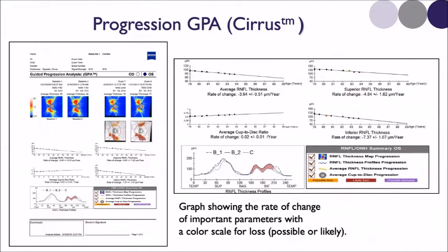Here what you're looking at is the printout from the Cirrus. This is just a blowup of that lower area. What you're looking at here is the optic disc cube. The advantage of having a cube of data is that the measurements are more reproducible than if you just scan a circle, and it also gives you information about the tissue thickness beyond the borders of that circle, both closer to the nerve and, more importantly, further away from the nerve.